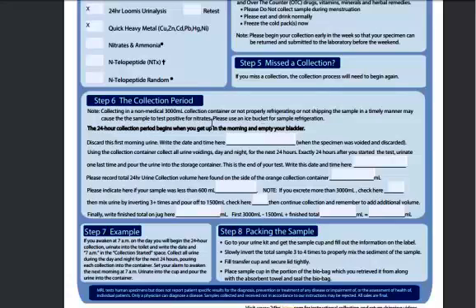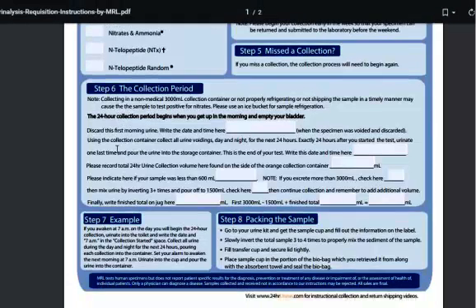Okay, so use an ice bucket for sample refrigeration. Some people put it in the refrigerator, but it's urine in the refrigerator. So I just think it's nice to keep a cheap $1, $2 little foam cooler or a little trash can that you have. Put a little liner in it with some ice and put your 3,000 milliliter container in that, and just keep the ice for 24 hours. Shouldn't be a problem.